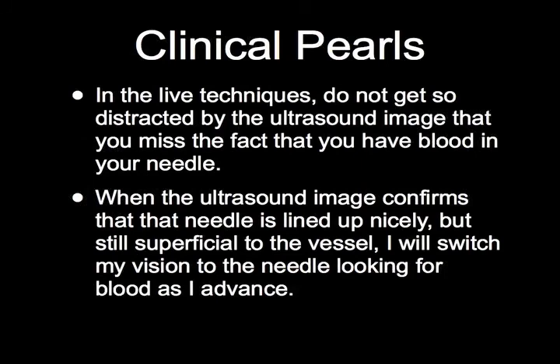Clinical pearls. In the live techniques, do not get so distracted by the ultrasound image that you miss the fact that you have blood in your needle. When the ultrasound image confirms that the needle is lined up nicely, but still superficial to the vessel, I will usually switch my vision to the needle looking for blood as I advance.